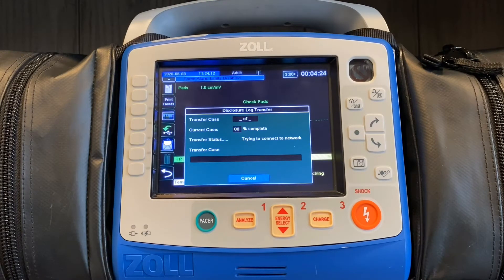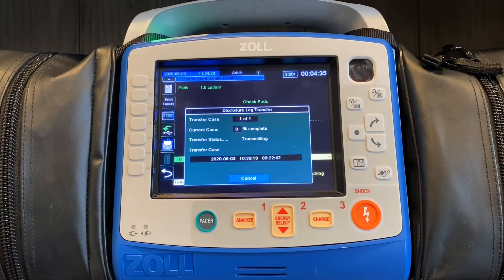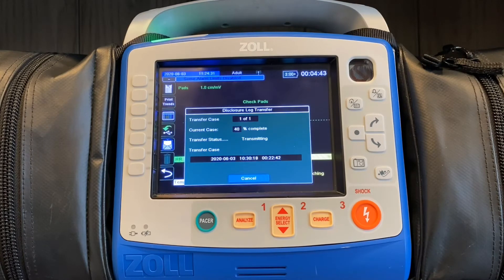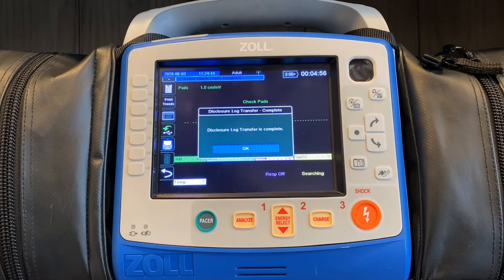What determines the length of this process is how data-rich the call is. So if you have a really intense cardiac arrest call, there's going to be more information and more data to compile and transfer. You'll see it'll say transferring, current case, and you'll have a percentage complete right here. Once we get the message that says disclosure log transfer complete, the information in that case file has now been sent up to Zoll Online. Within Zoll Online, you have your Case Review account. Case Review acts as the conduit for the information to be passed to any of the ePCR platforms you may be using.